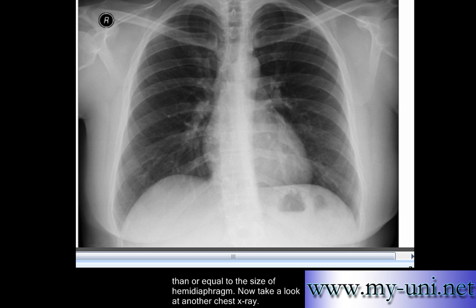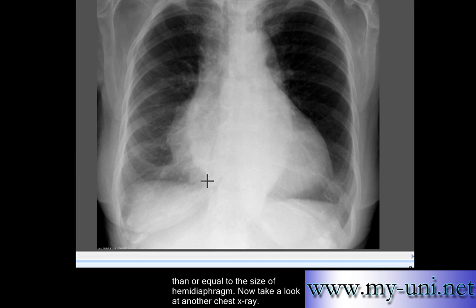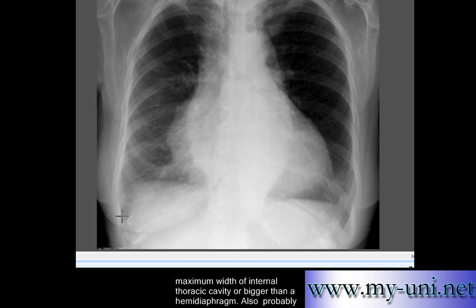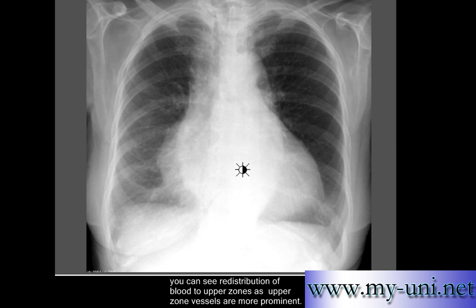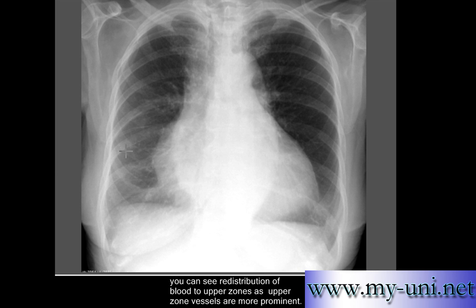Now take a look at another chest x-ray. You can quickly see the cardiac shadow is enlarged, more than half of the size of the internal diameter of the thoracic cavity. You can also see redistribution of blood to the upper zones — the upper zone vessels are more prominent than lower zone vessels — as well as a prominent horizontal fissure, or minor fissure.